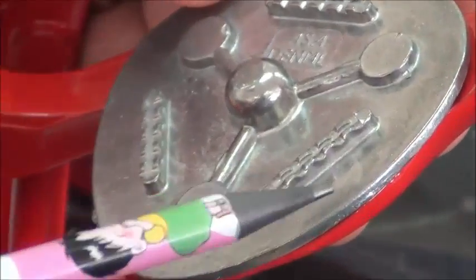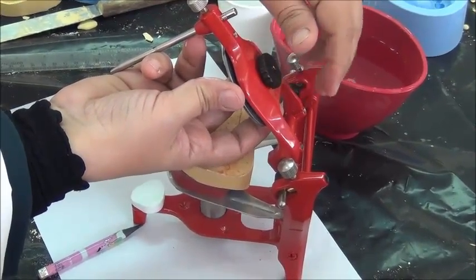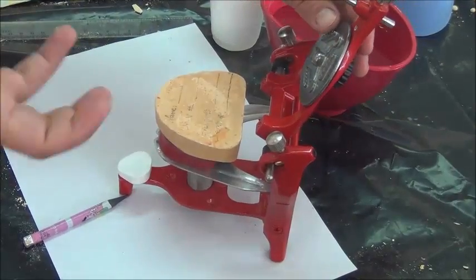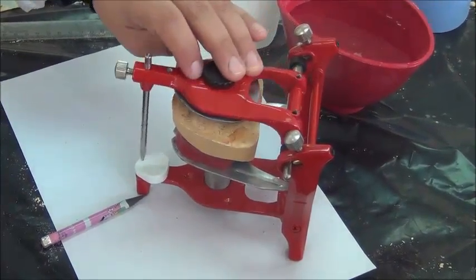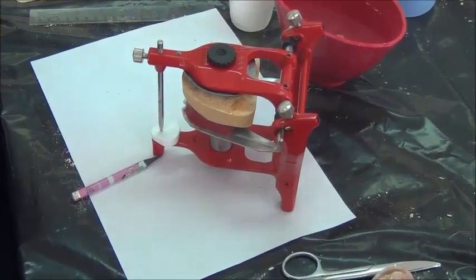So the articulator has what we call an upper ring. This is a ring that can be detached, but for the case of mounting, we keep it attached, and it has some locks and irregularities in which the plaster will go in and retain to it mechanically. And we can add some of the plaster a bit over just the margin of this articulator.